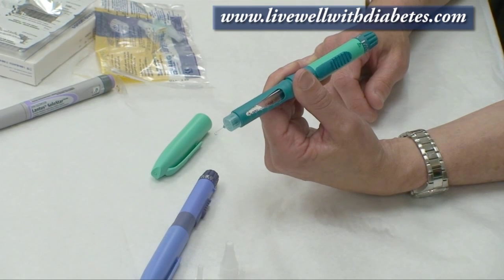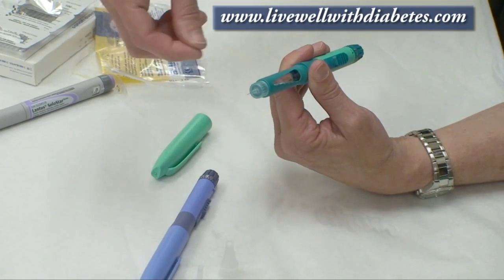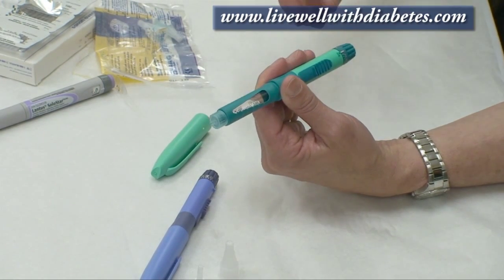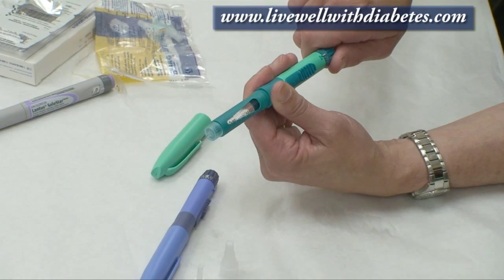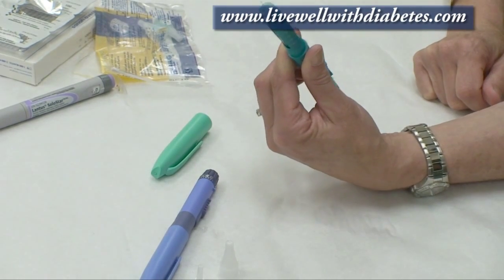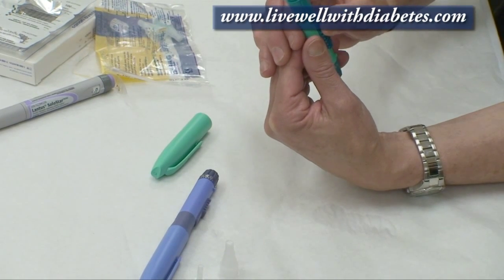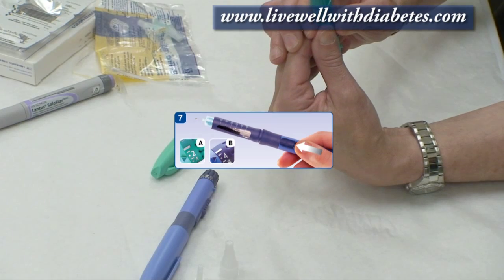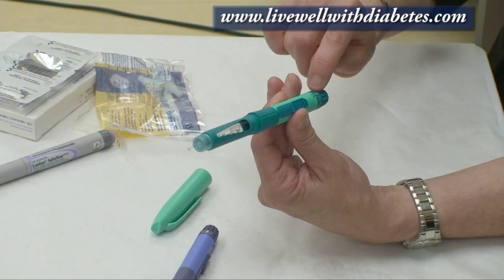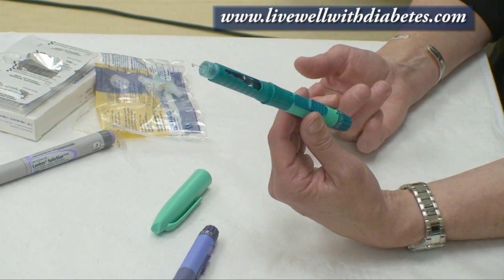If I was using this for the first time, I put the needle on, take both caps off, and then prime it — also called the safety check. To do the safety check I turn the dial to number four, point the needle up to the ceiling, put my thumb on the slide button and slide it all the way up, and I'll see the insulin come out and the dial will return back to the solid line. If I didn't see any insulin come out, I repeat that step.